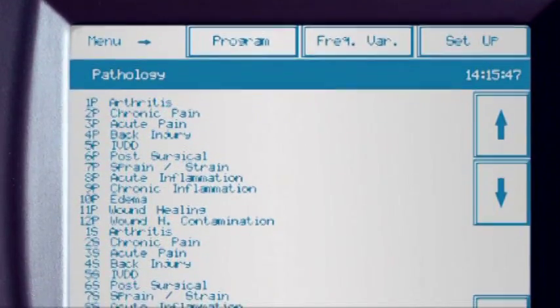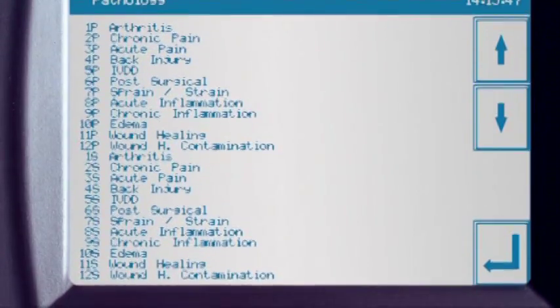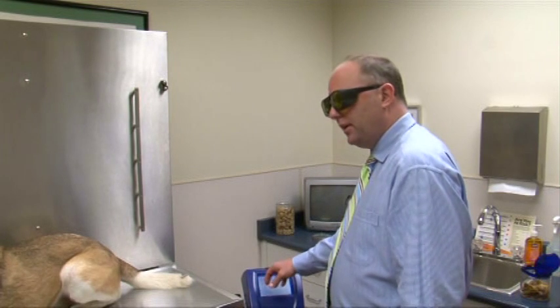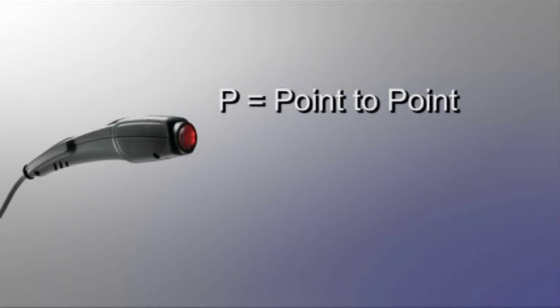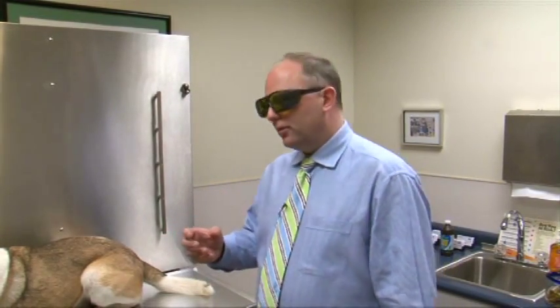As you can see on the menu, each indication has two different ways of delivering laser therapy energy. When we look at the menu and see a 1P or 2P, the P indicates that treatment will be delivered point to point. The S indicates that treatment will be delivered via the scanning methodology. Both of these methodologies are outlined in the MLS user's guide.